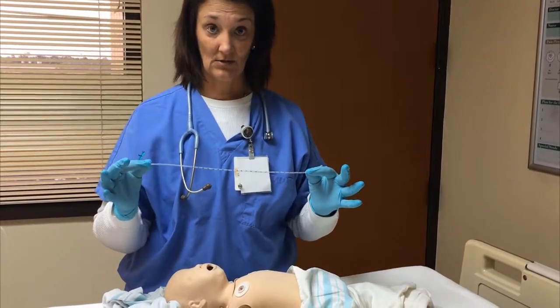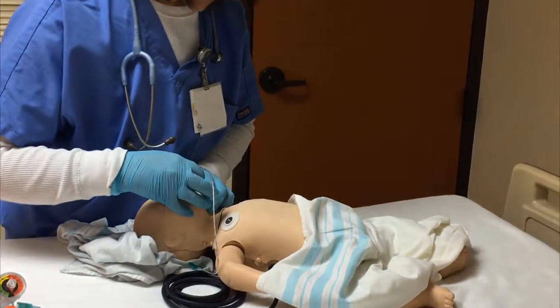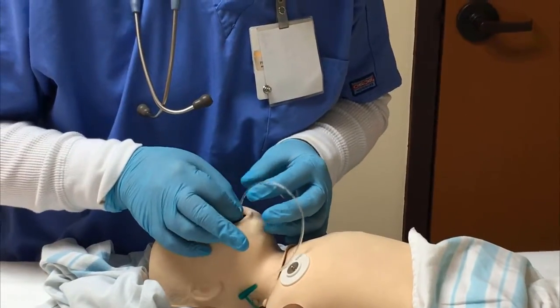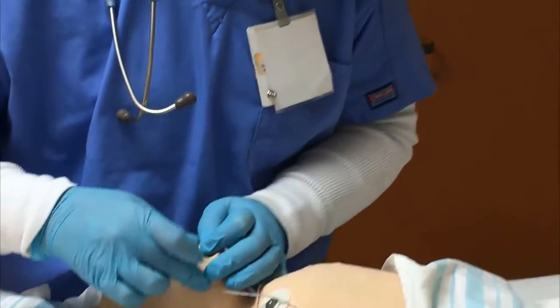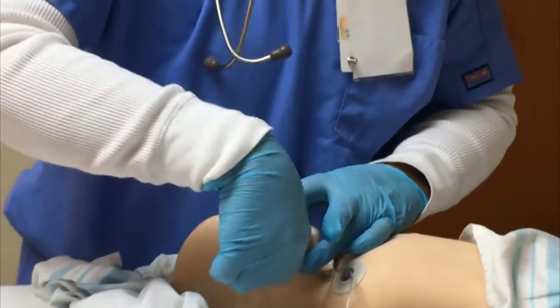So now what we can do is we can go ahead and insert the 8 French into the stomach. We go ahead and manually insert it until we get to our predetermined marker. So I've reached my 11 centimeter marker, and I'm going to gently tape it on the side of the baby's face.